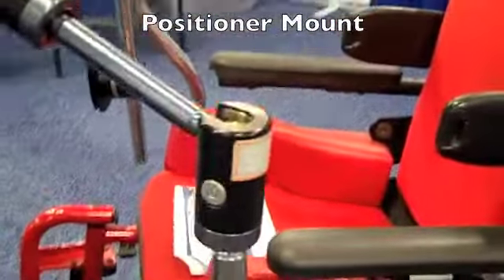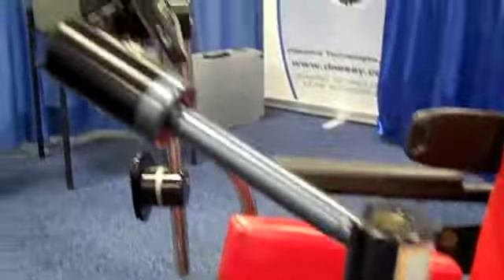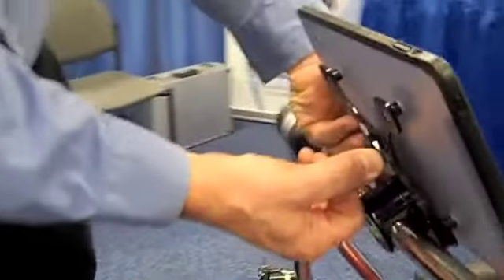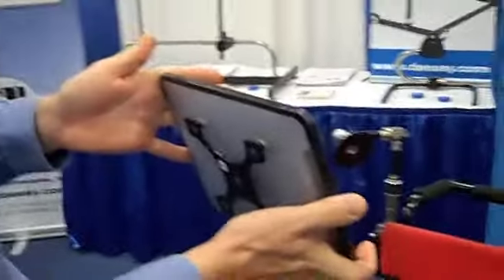On this wheelchair right now I've got two different mounts. This particular one is called our positioner mount. We've got a bunch of different highly adjustable joints that allow you to get the device exactly where you want it and keep it there securely. Right now we've got an iPad attached to this. Our iPad holder allows you to mount it in one of each different orientations, so landscape or portrait.